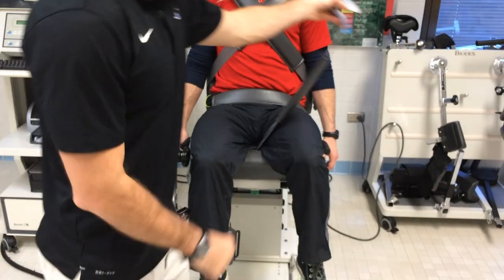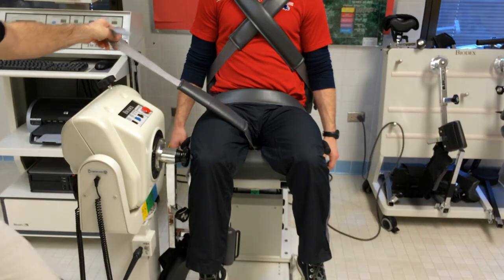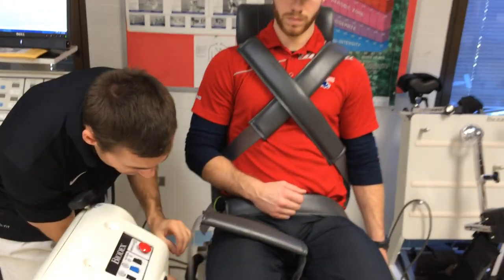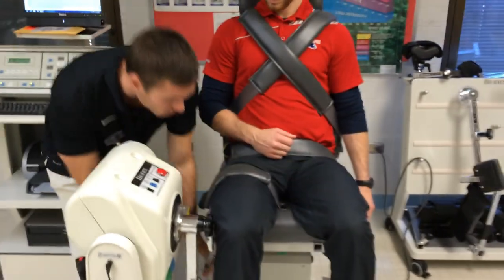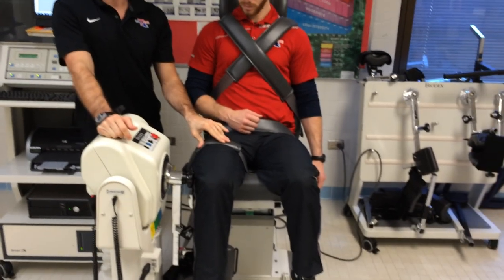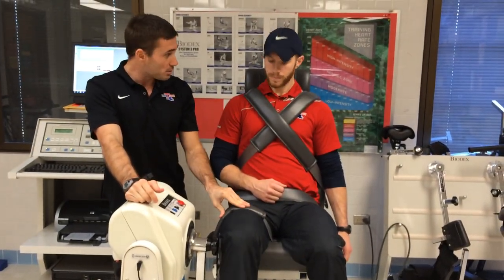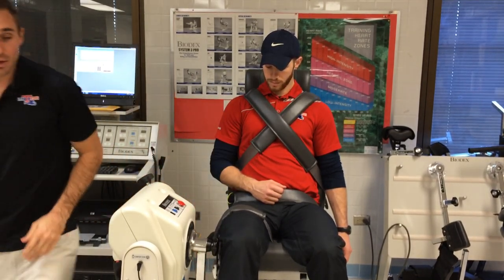Now, we see his thigh strap. This could go either way. We want to make sure it's going over the leg that's being tested. So we pull it over to the side here. We find the appropriate clasp where it's locking in. This one we're going to pull really tight again. A good rule of thumb, we're going to pull it as tight as they're comfortable with. Some people are going to vary a little bit. This is okay for you? So he's not able to move his leg too much. And then we're going to do his ankle.